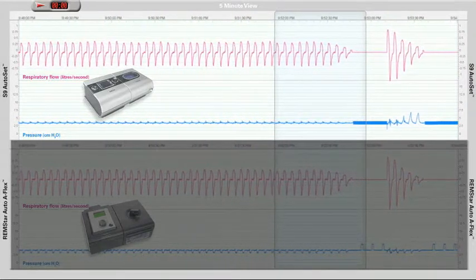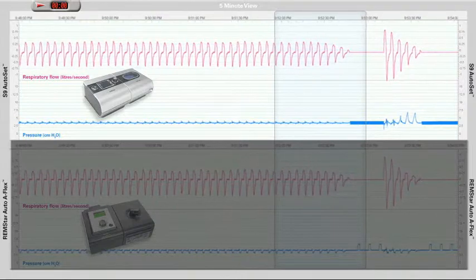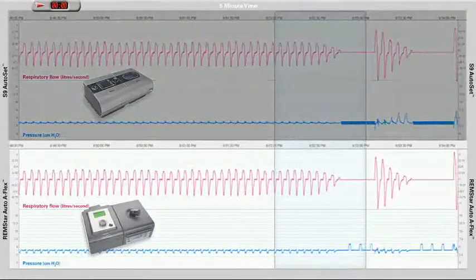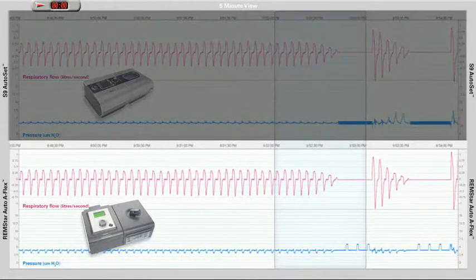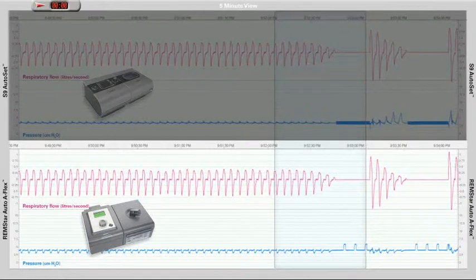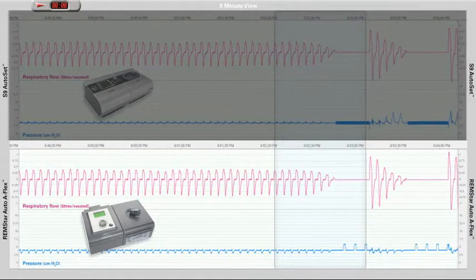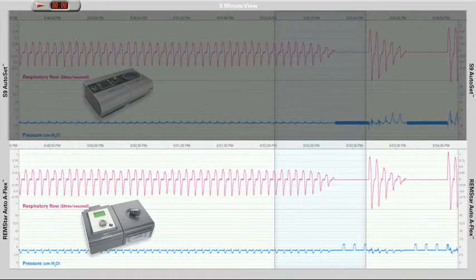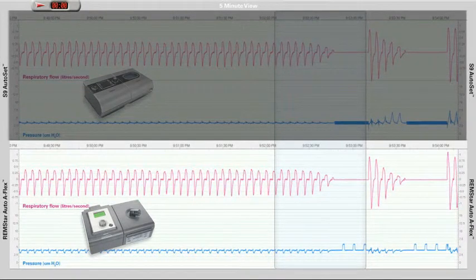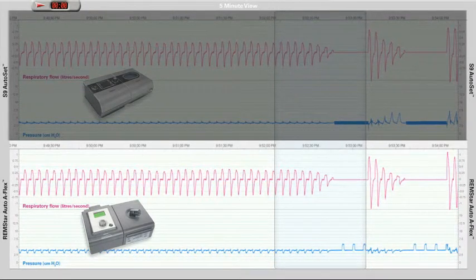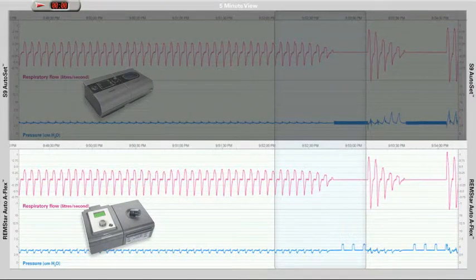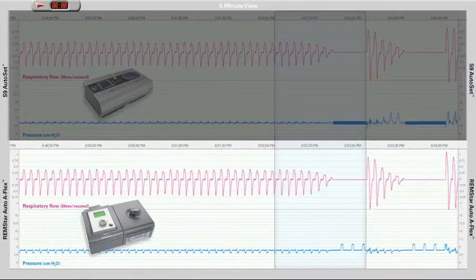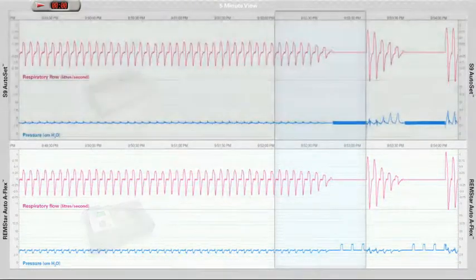The second two traces show respiratory flow and the measured mask pressure from a patient using Respironics OptiLife Nasal Pillow System and the Remstar Auto APAP device.